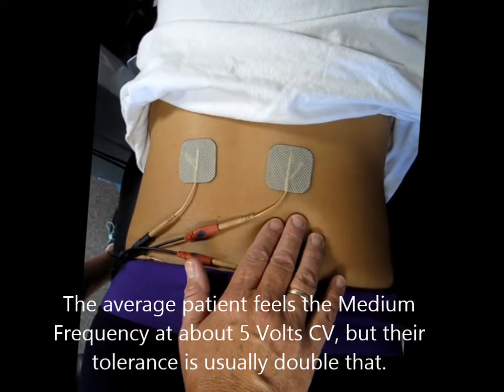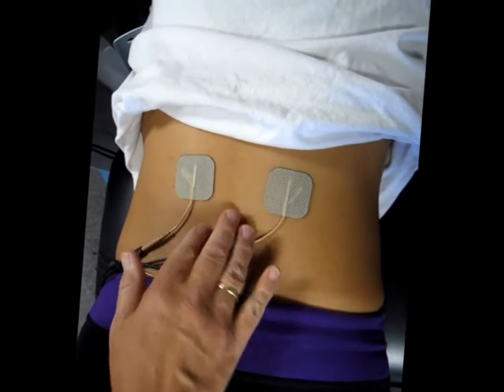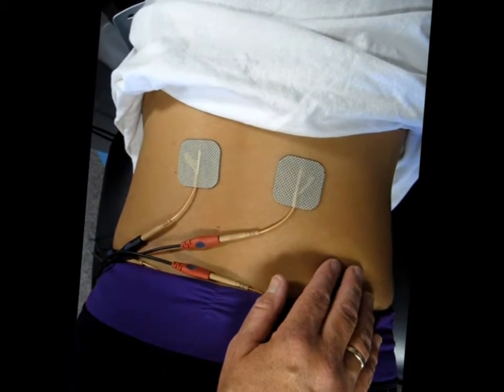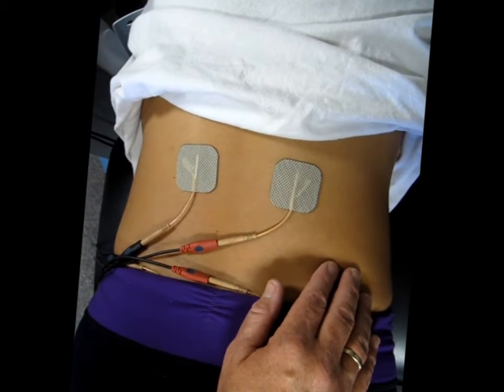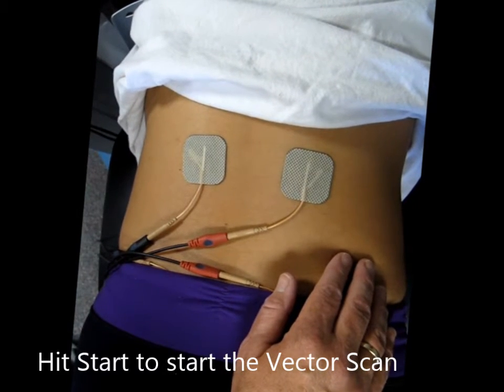And now what I'm going to do is hit start and let's see if we can see a difference. Sometimes on some people you can get the contraction so high. If you think we can go higher to make a bigger contraction, you let me know. So what I'm going to do is turn off the vector scan and bring up the intensity. I'm at 4, 5, 6, 7, 8, 9 — I'm at 12 now.